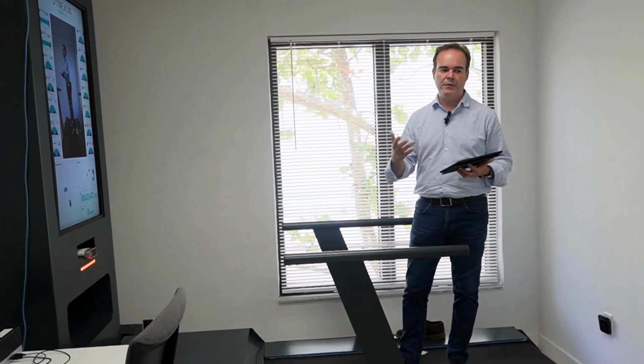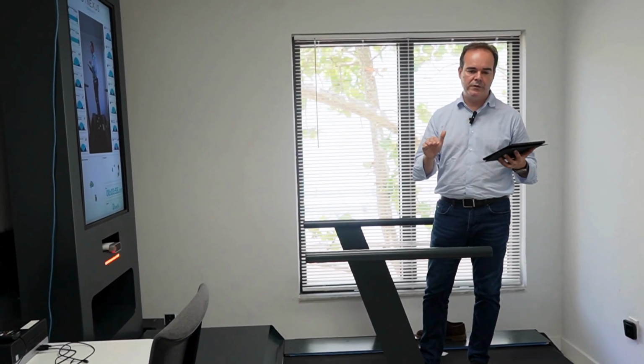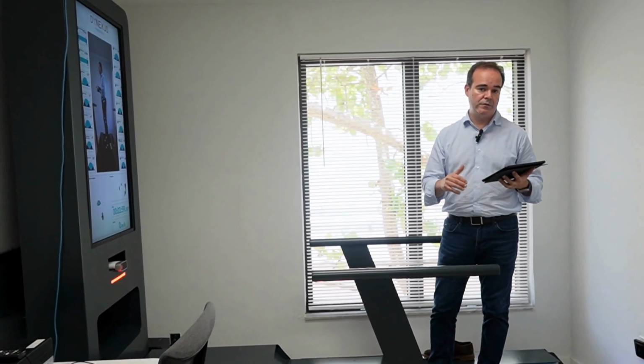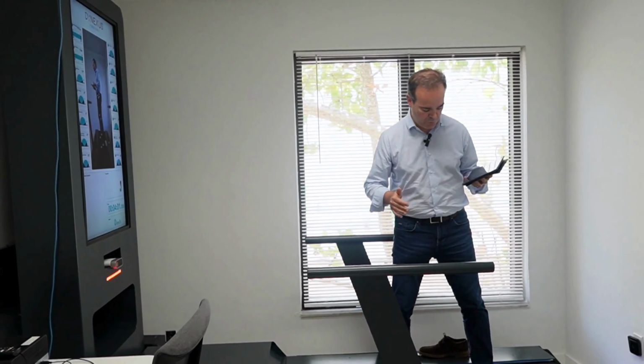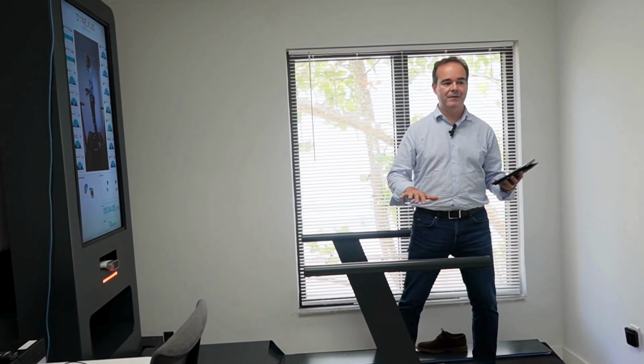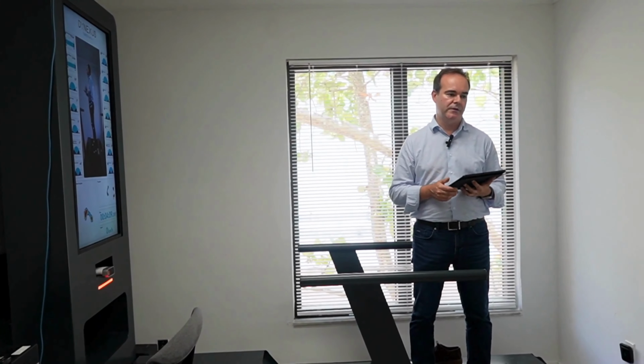For example, Parkinson's: people have immobilism trying to move, and there's not a fluid movement, and they lose balance first. What we try to do is give them balance, so they don't need to be modifying their position, and they can have a more fluid walking.